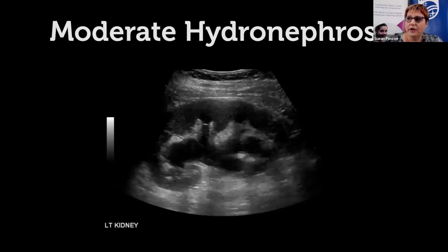When we have moderate hydronephrosis, you can start to see we've still got quite angular calyces, but it's a little bit more prominent through the pelvis here. And we also have the renal cortex maintaining its thickness.